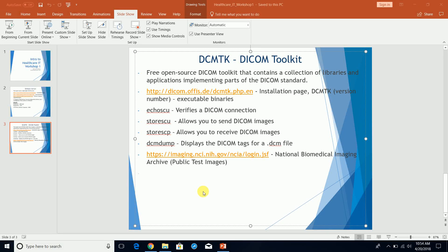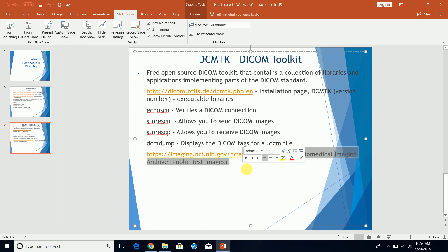Next, we're going to come back to these DCMTK commands. In order to use them, we need to have some DICOM images. So let's download some DICOM images.